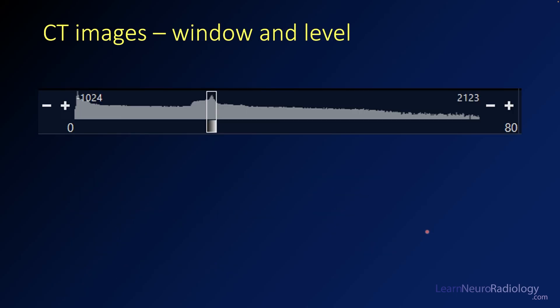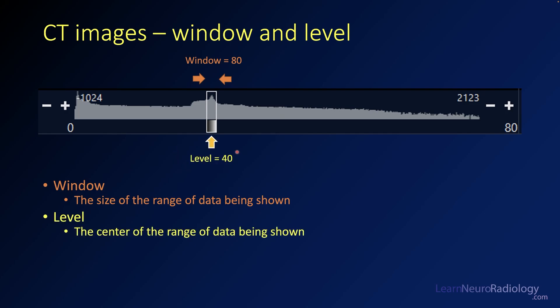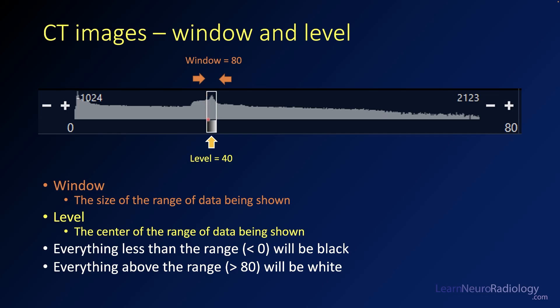We need to control how much data we're seeing, because if we look at the whole range we can't tell the difference in fine structures. This is where window and level come in. The window is the width of the range of data being displayed — for example, if we're showing from 0 to 80, the window would be 80. The level is the center of that range. So with a window of 80 and a level of 40, the range is 0 to 80. Everything below that range appears black, everything above appears white. This is a key principle: if a value is outside the window range, you're not going to see it.